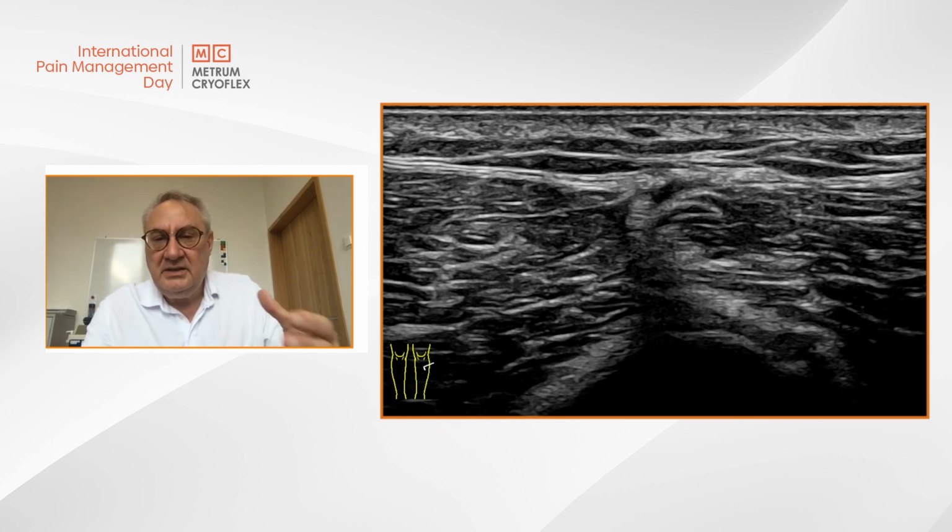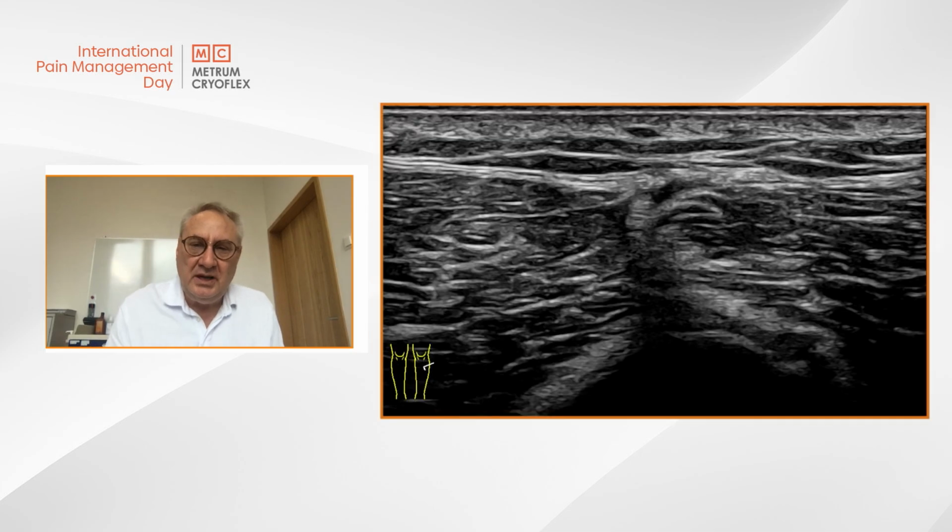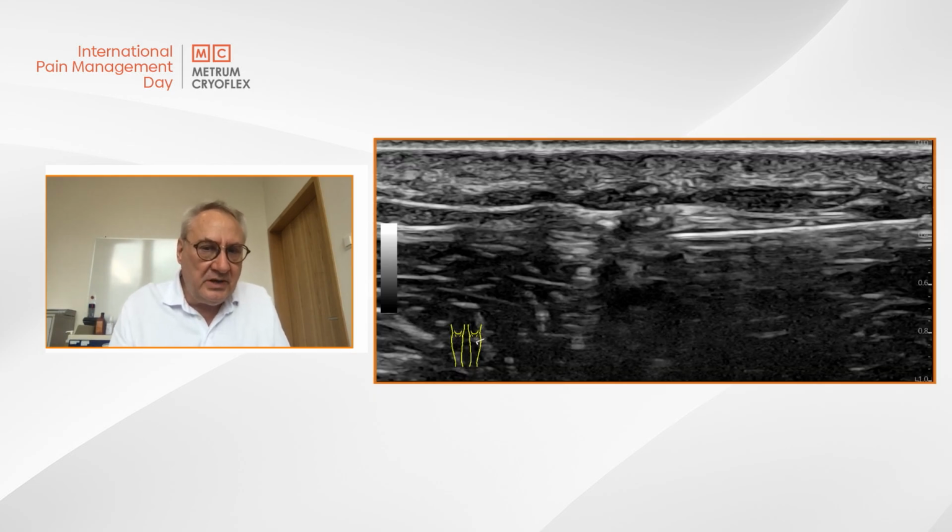And this is also the cause why the patient had such a problem, because the nerve is very subcutaneous, and probably through keeping his legs under the stool, under the chair, and pressing against it, he caused the entrapment of this superficial peroneal nerve. So that's what we do at first. We repeat it again, and if it doesn't really help, then we do a cryoablation.